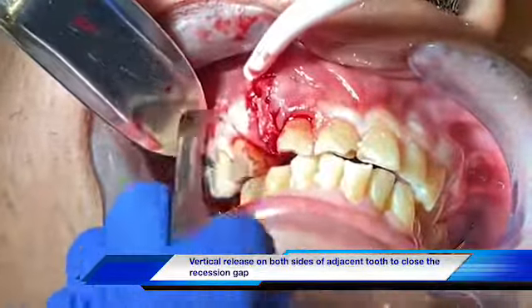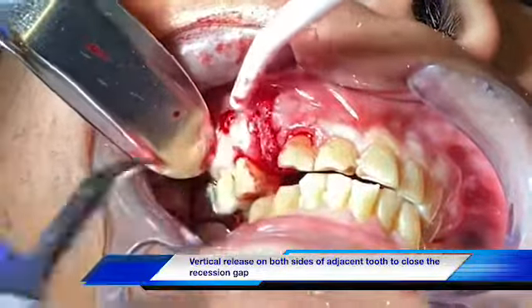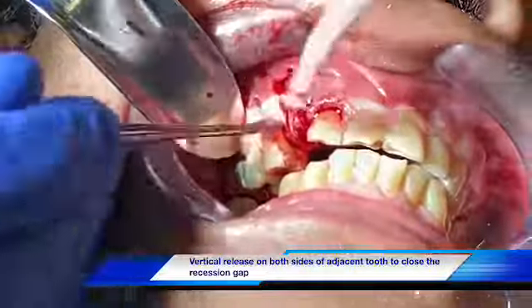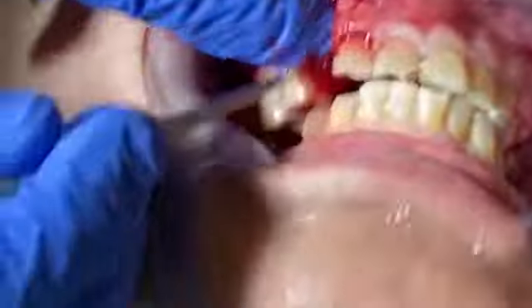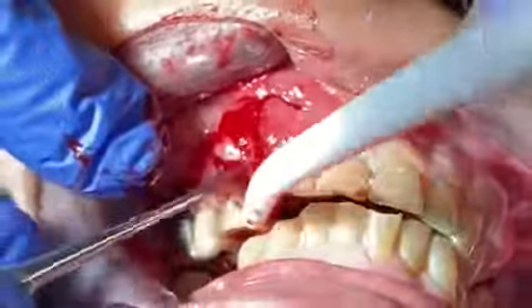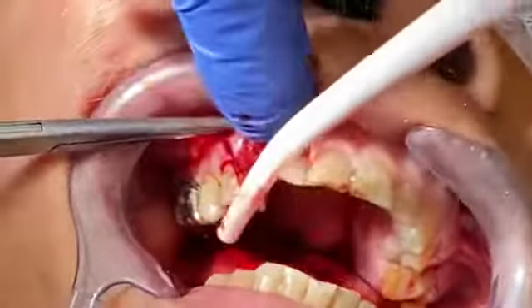The benefit of not doing the bone graft immediately today is also because there was so much infection in that area. So by cleaning all the soft tissue and placing the collagen membrane right now, it substantially helps reduce the infection of the socket area and prepares for the future bone graft. It's not a bad idea — we can do both bone graft on the same day, but it's more predictable this way, simply allowing the infection area to reduce and minimize the potential for chronic infection later on.